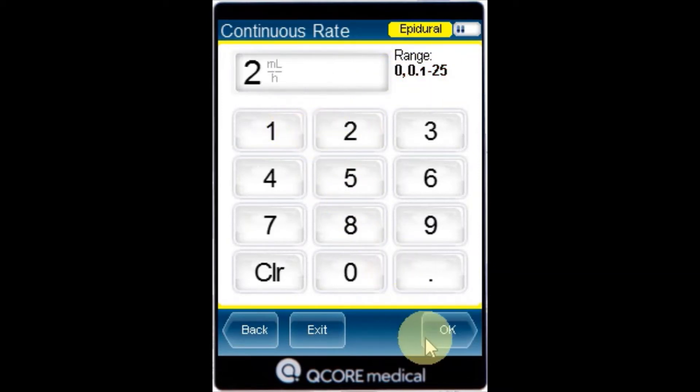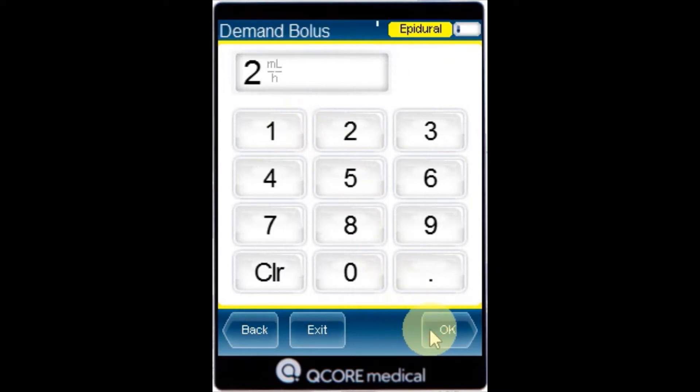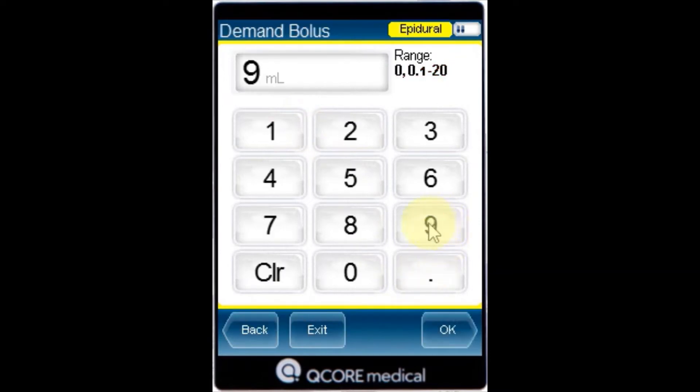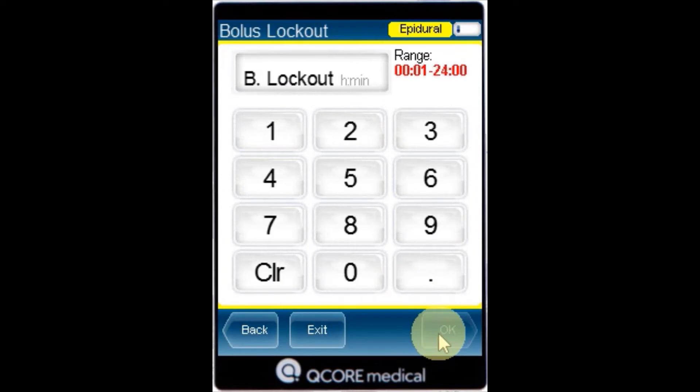Using the keypad enter the value for the demand bolus and press OK. Using the keypad enter the value for the bolus lockout and press OK.